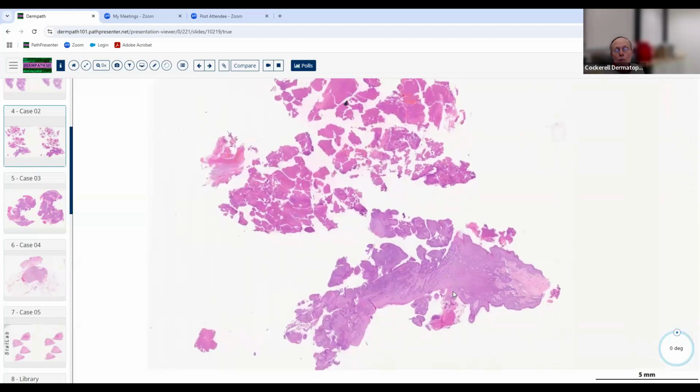And so the same thing is true on volar skin, where you've got a thick cornified layer. A lot of people send us biopsies to rule out melanoma, and they send us only the cornified layer because they haven't gone deep enough. Maybe the patient barely bleeds. So you have to get down in, and you have to see that you're cutting into the papillary reticular dermis, or you're not going to get an adequate biopsy of something like this.